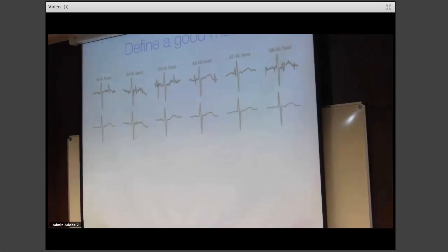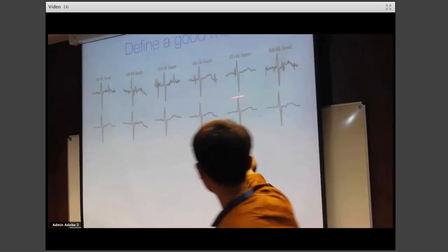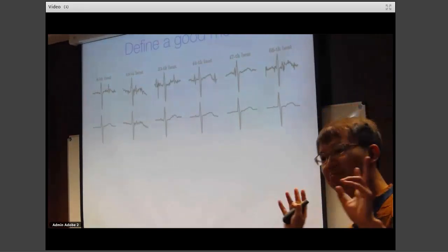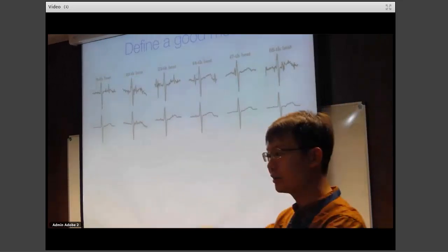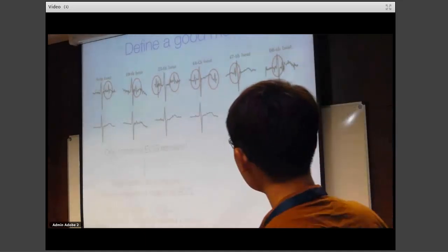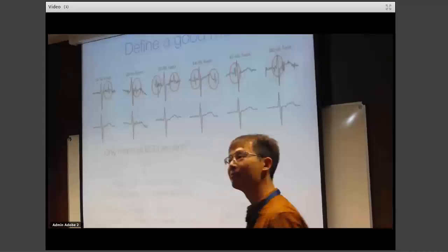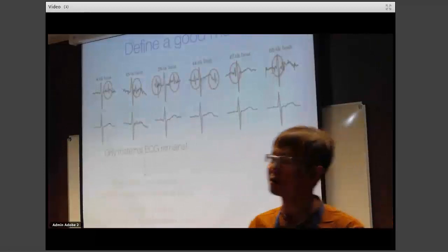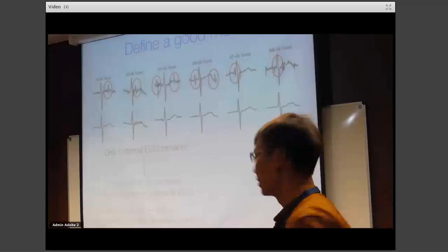So this is the picture. This is the noisy, contaminated maternal ECG, and this is after denoising. So you already remove the fetal ECG, or separate the fetal ECG and the maternal ECG. And those are fetal ECG. And what you can do is design some kind of new metric to determine who will be your neighbor, who will be very close to you, or which maternal beats will be similar.